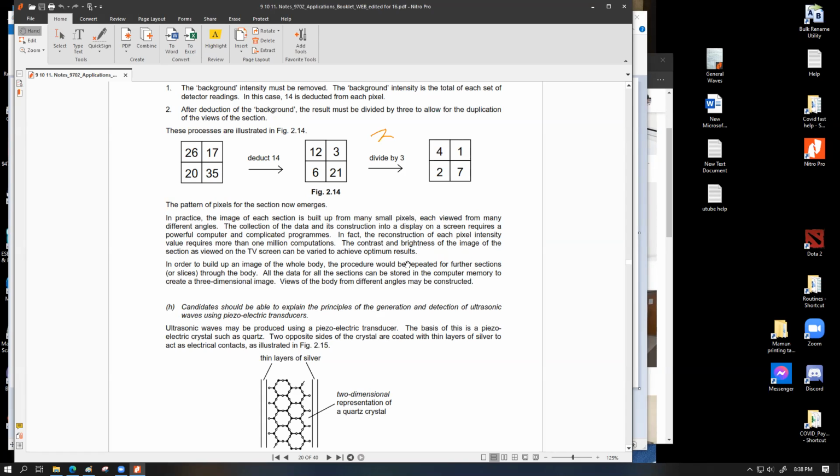So whenever we do the CT scanning, if there is a certain tumor growth or some external body, let's say a person got shot and has something sharp in their body, we do the CT scanning and we can very precisely look at exactly in which three-dimensional coordinate a specific object is, which is not supposed to be there. That is the anomaly for that person compared to a healthy person, because we can compare those values with a regular person's values that we know from earlier scans, and then we can know that this thing is not supposed to be there because it is apparently the anomaly.